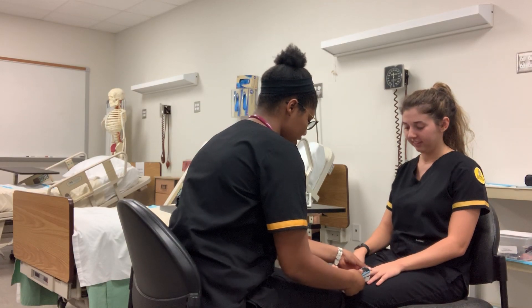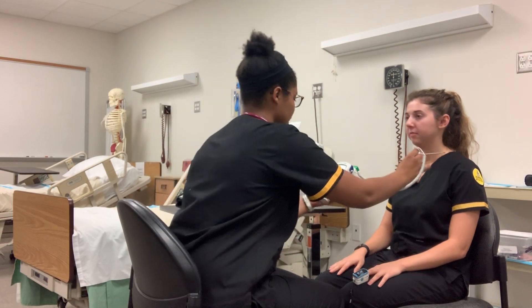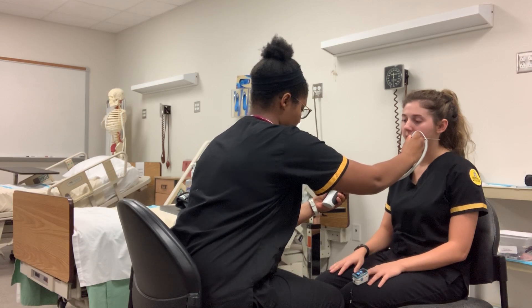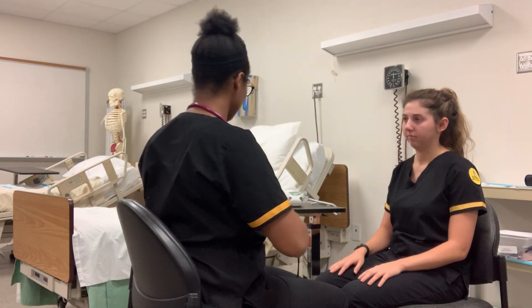First I'm going to take your pulse oximetry and your temperature. We don't have any probes, so I'm just going to simulate this. Your temperature is 98.8, which is within normal range. Your pulse ox is 98, which is also normal.